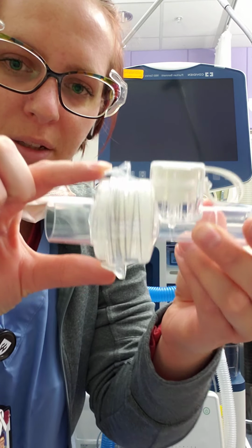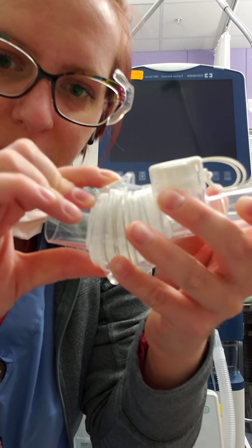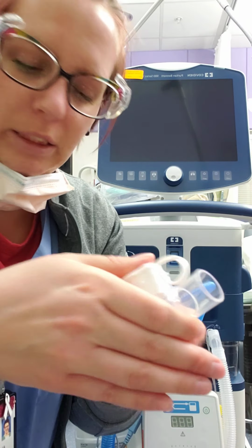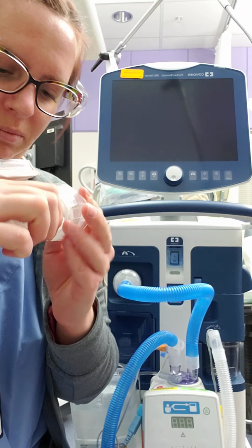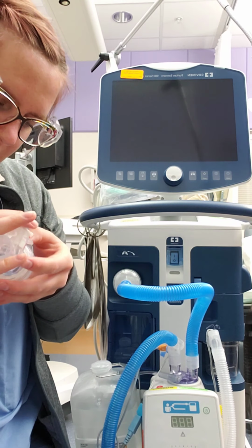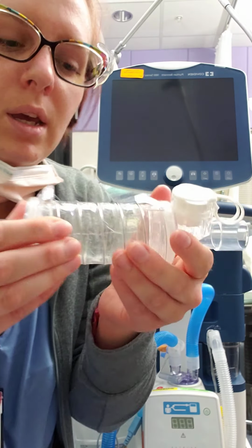You just undo it by unclipping when you are administering a medication. Maybe. Sorry. Yes, things like that happen all the time.